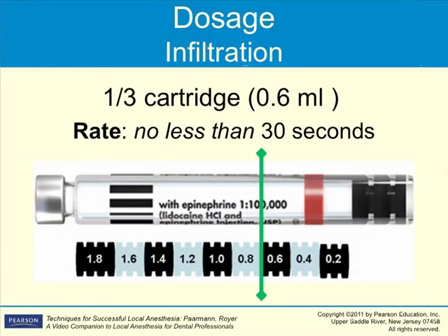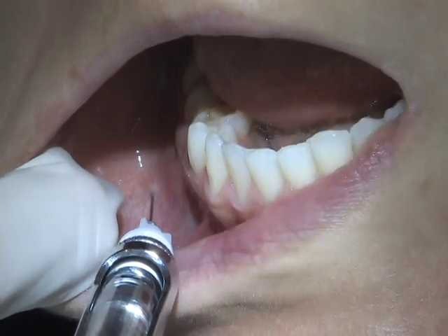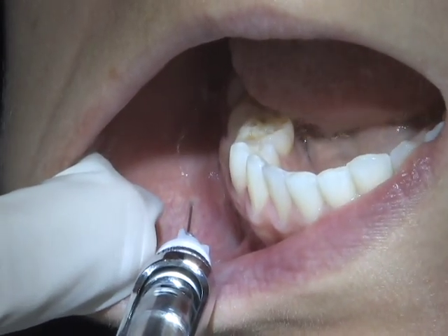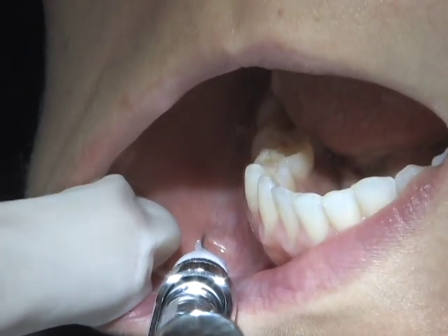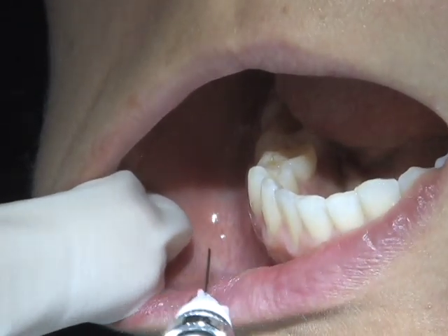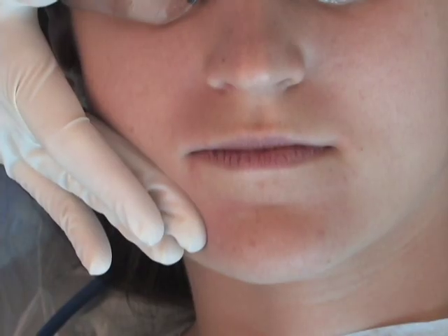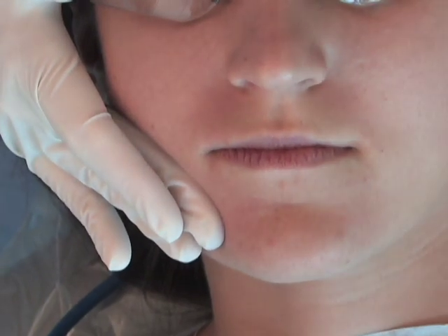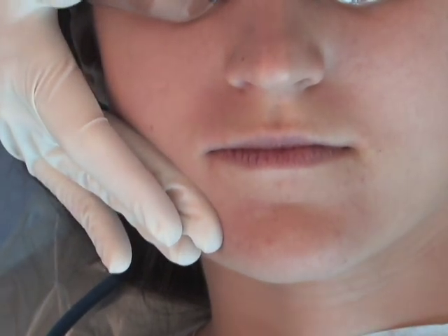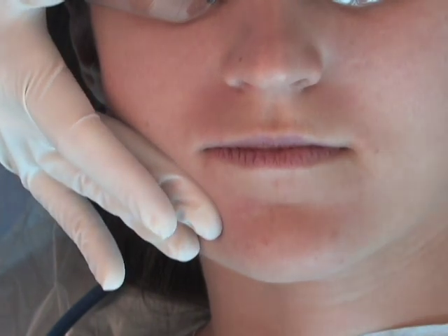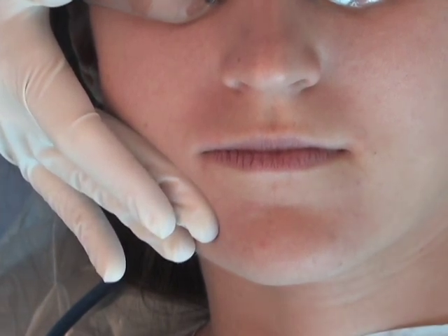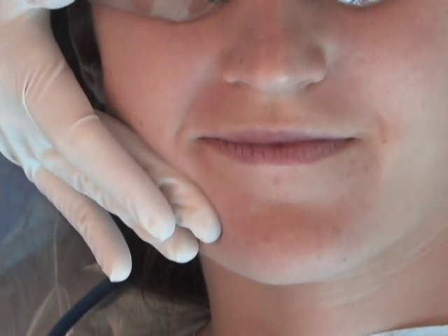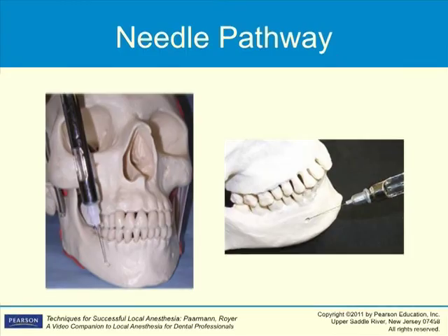With either method, deposit approximately one-third of a carpule over 20 to 30 seconds. If the injection is completed at this point, only soft tissues innervated by the mental nerve will be anesthetized. After gently withdrawing the needle and making it safe, apply pressure at the injection site for a minimum of one full minute. This pressure can be applied by the clinician or by the patient. To obtain anesthesia of the teeth or pulpal tissue, gentle finger pressure must be maintained directly over the injection site to increase the volume of solution entering the mental foramen. This may be accomplished with either intraoral or extraoral pressure.